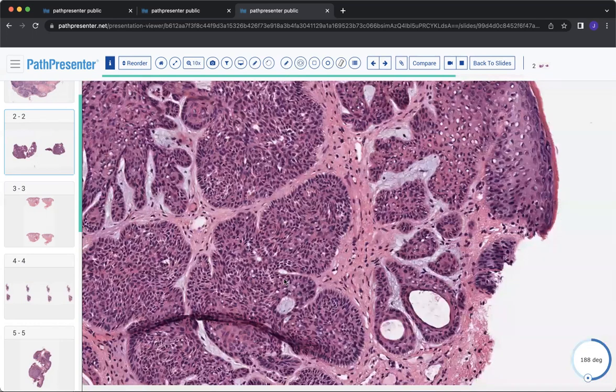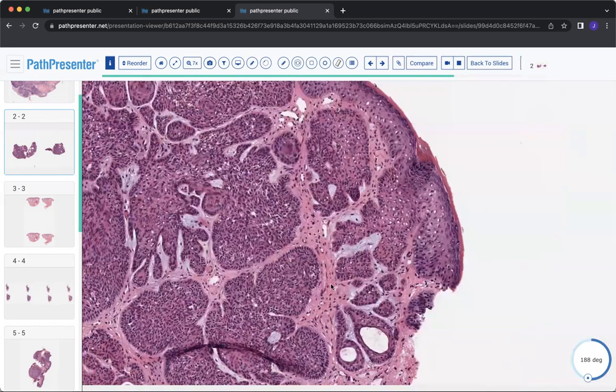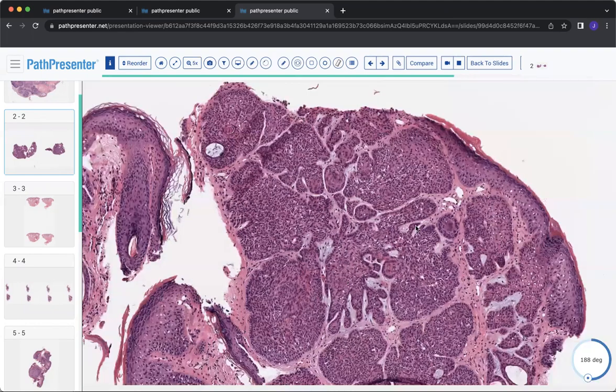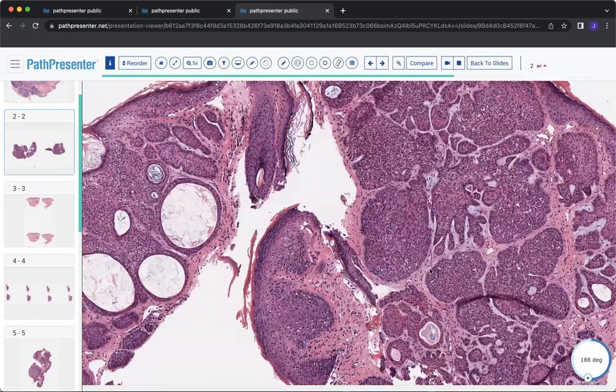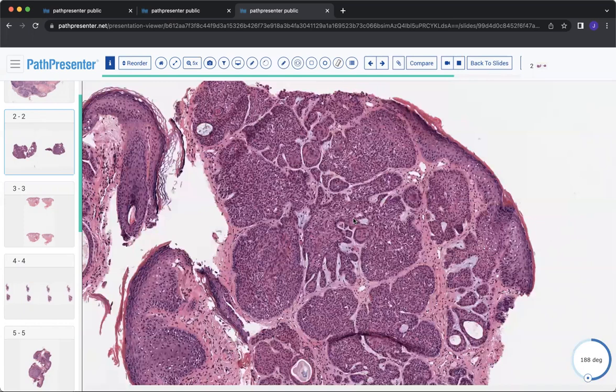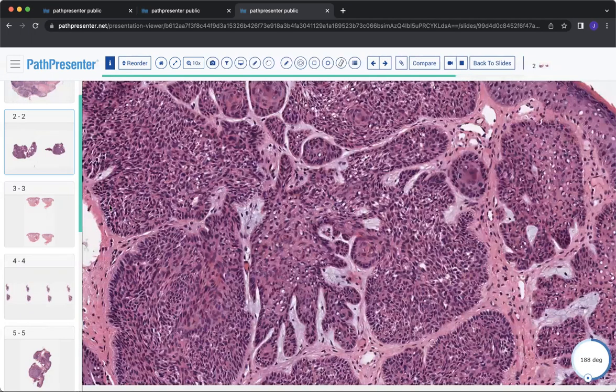So when you get all that together and you make the assessment along with the histology, the architecture, and the clinical scenario, then it can push you one way or the other. So in review, this was called a trichoepithelioma, and you should know the basic features of trichoepithelioma.